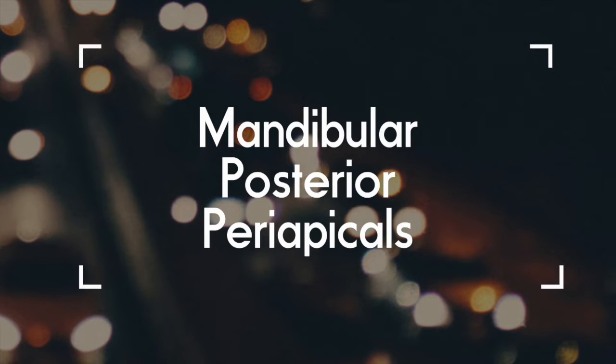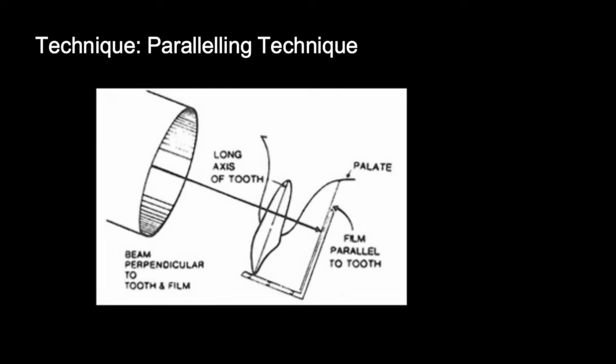This is an instructional video on how to take a mandibular posterior periapical film. We will be showing the paralleling technique in this video.